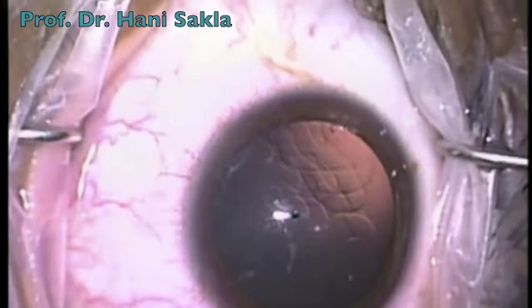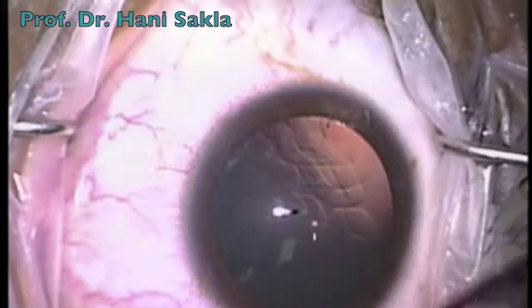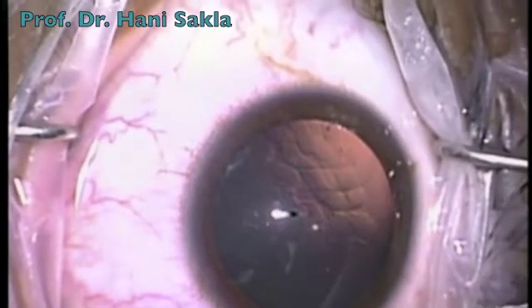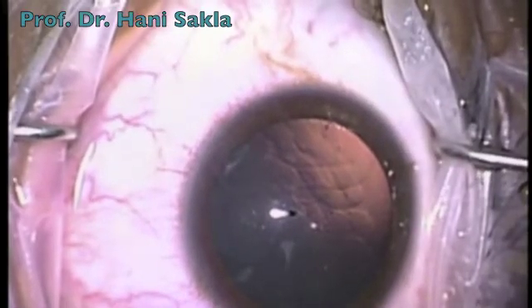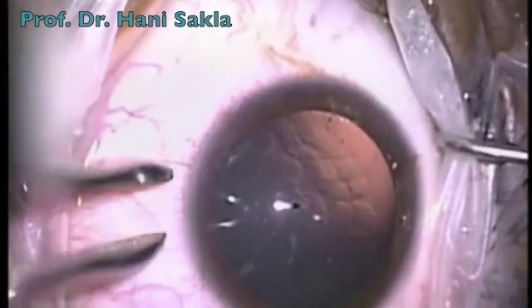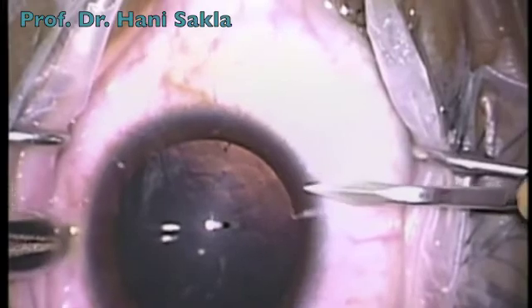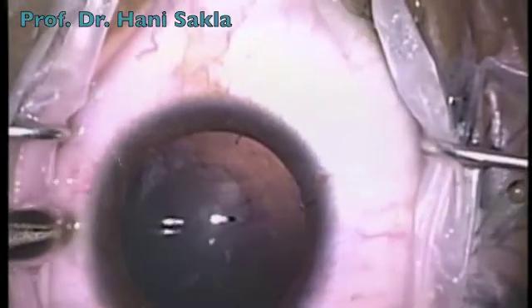Try to avoid overfilling and always keep the viscoelastic in front of the iris, not behind the iris. We do a paracentesis opening near the distal end of the ICL. Most people usually do two paracenteses at 6 and 12 o'clock, but only one paracentesis is enough.